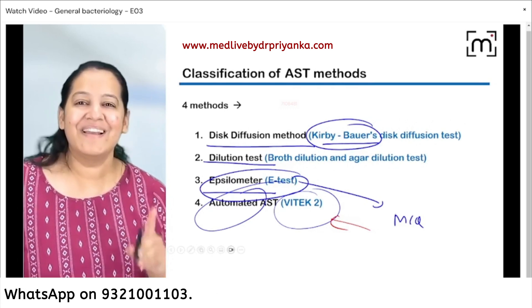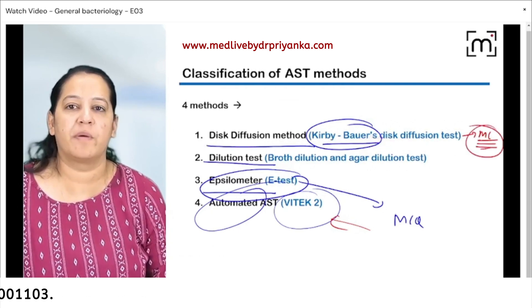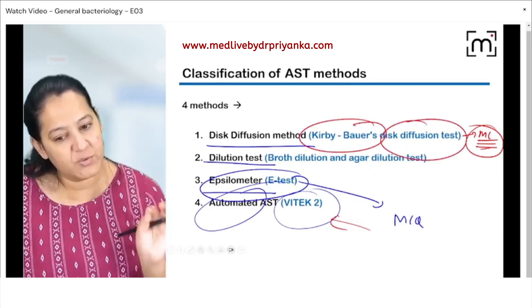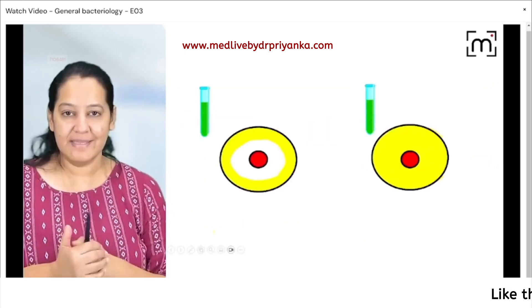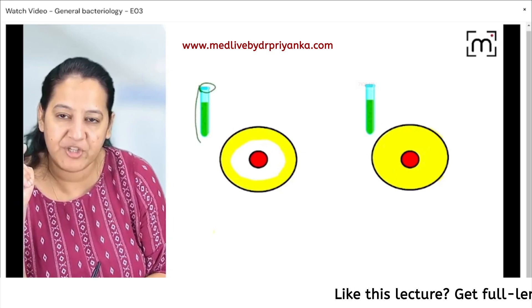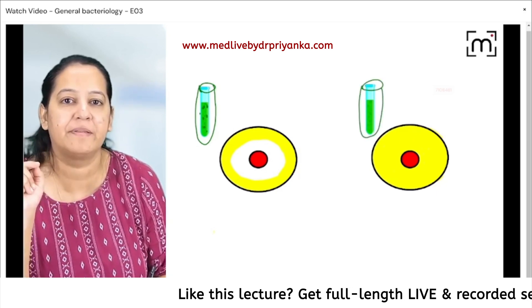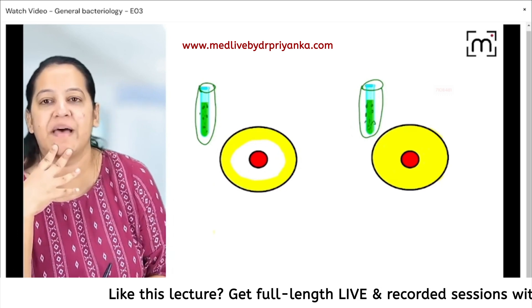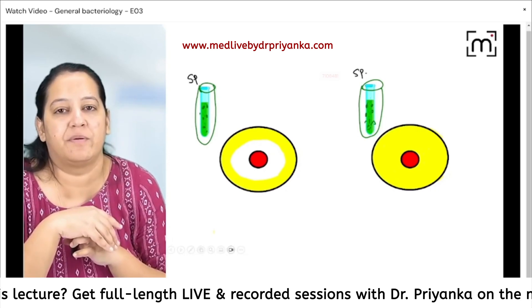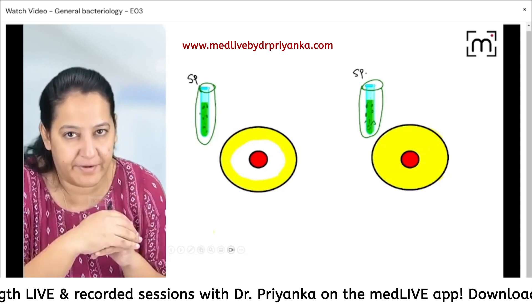Let's start with the first method: Kirby-Bauer disc diffusion method. Among them, this is the most common method. This is my patient sample taken out of the body — it contains bacteria. You can see the dots — it's a bacterial suspension. The sample can be blood, urine, stool, CSF, saliva — whatever it is, the point is that it contains bacteria. Now I will take agar plates — this is Mueller-Hinton agar (MHA), a sort of basic agar — which contains nutrition for the bacteria.